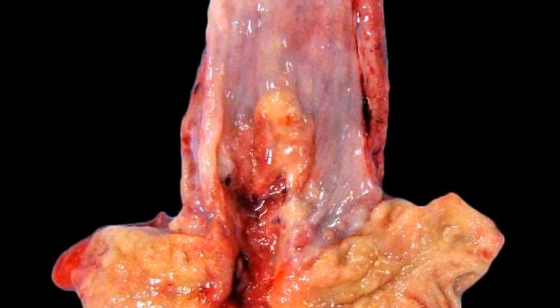Next is esophagus adenocarcinoma. You can see an ulcerating lesion near the lower part of the esophagus, and it is elevated, and you can see the margin is rolling, and the base is necrotic and dirty with areas of hemorrhage and necrosis.